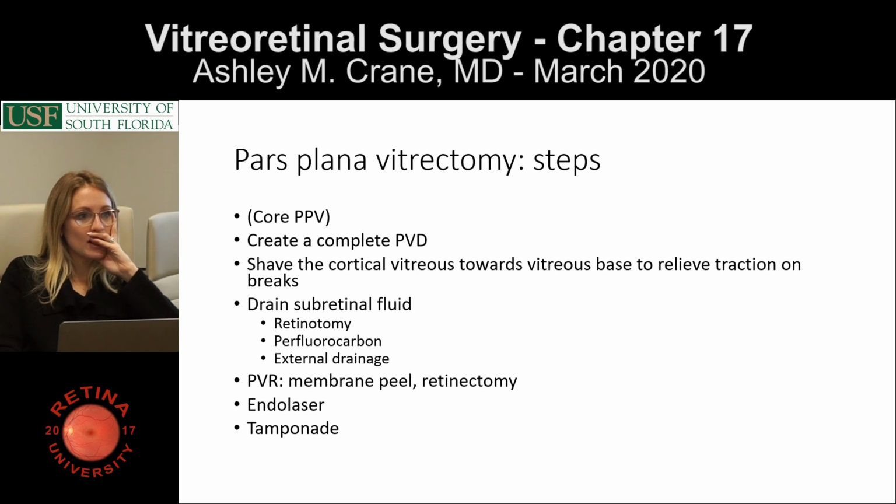Okay. And then after that, you want to shave the vitreous around. Yep. Breaks, and especially more peripheral. Exactly. And then after that, you want to make sure that you visualize all the different breaks. Yes. Great. As long as all the vitreous traction has been relieved, you could either do endo laser, or if it's a really bad one, you could put oil primarily, or you could do a gas tamponade.